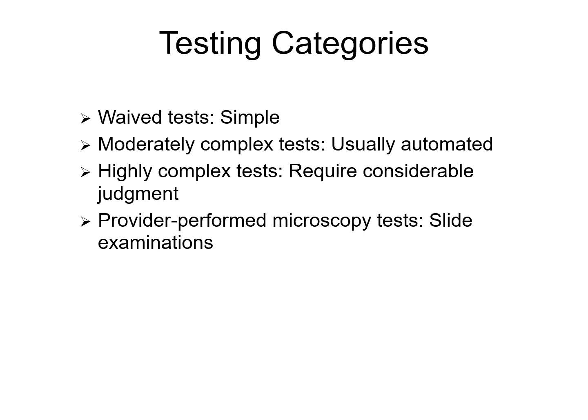A highly complex test, its characteristic is it requires considerable judgment for interpretation. Examples of this are rare or specialized serology tests requiring expert analysis. The requirements for highly complex testing are skilled laboratory personnel with detailed knowledge of procedures and interpretation, who have gone through all of the training and education needed.